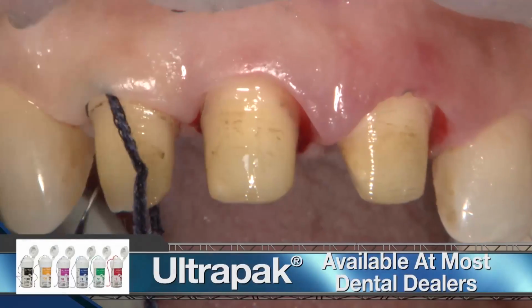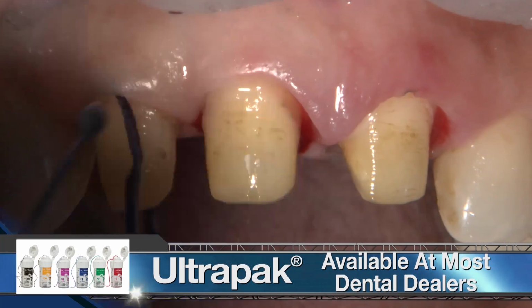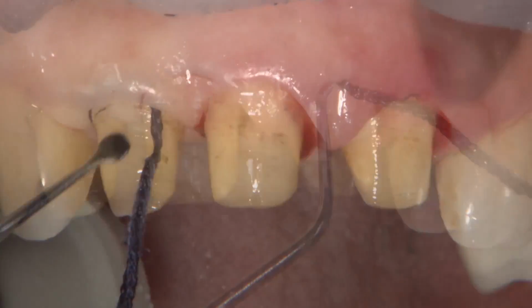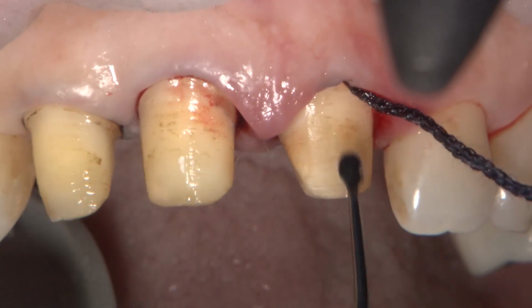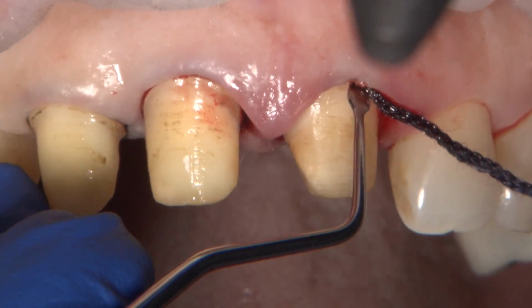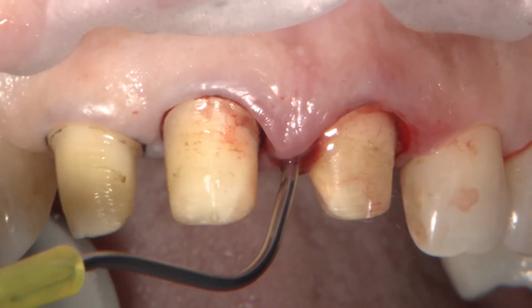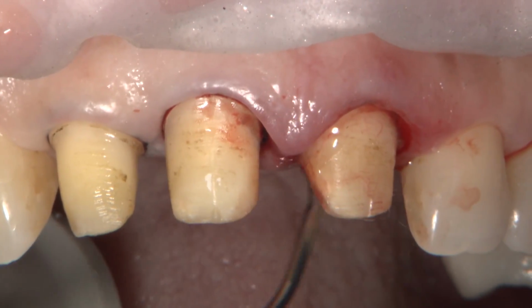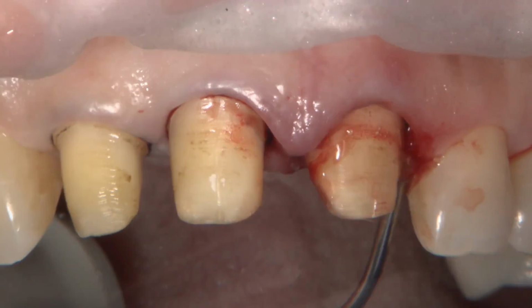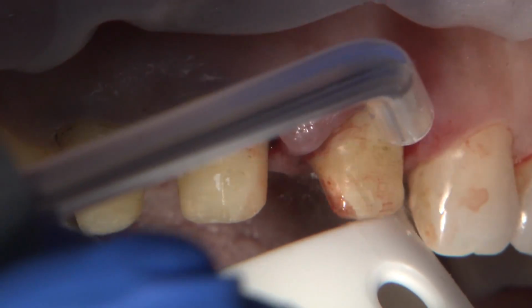I am packing now Ultra Pack 00 cord from Ultradent. I usually do this to provide a vertical gingival retraction of 0.5 mm and then drop the margin to the new gingival level. We can see these margins are already more subgingival than I would like them to be, and you can clearly see how I nicked the gingiva on number 9.